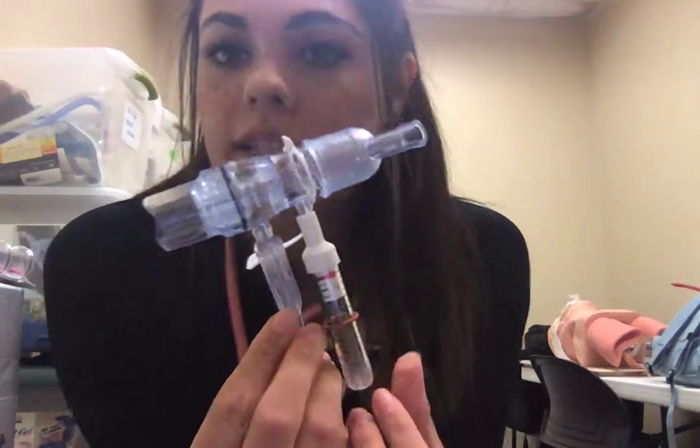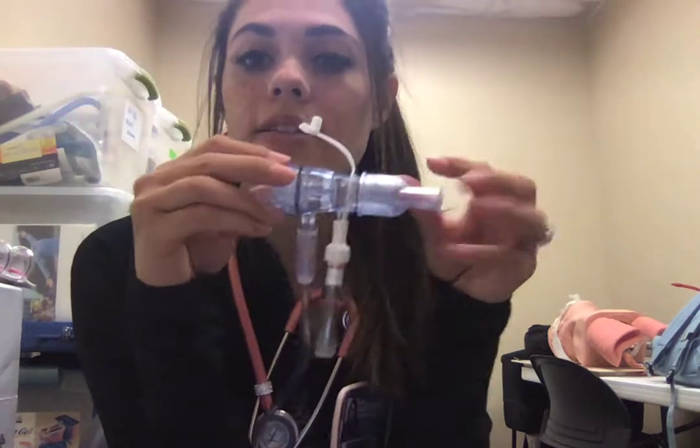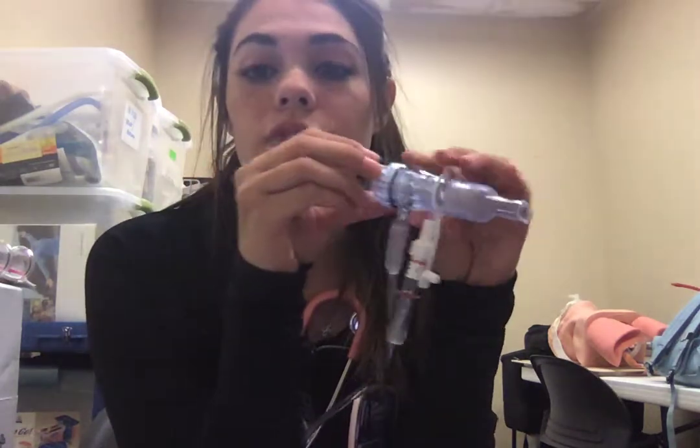I have my EZ-PAP device here. I'm going to use this on a patient who is post-op and we're seeing signs of atelectasis. We're going to use this to reverse that and prevent any more atelectasis from happening. This is going to force them to take big breaths and open up any alveoli that are not being recruited or have started to shrink a little bit.